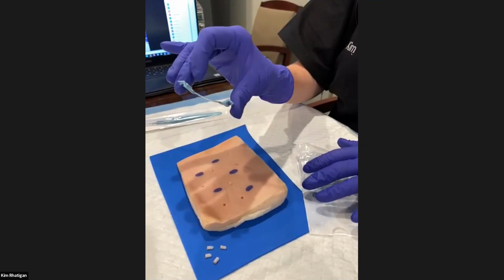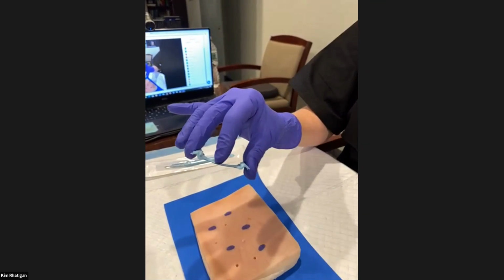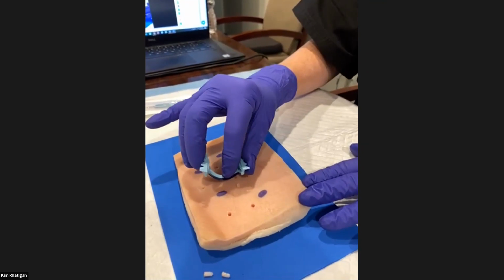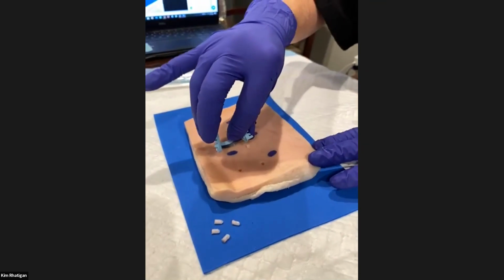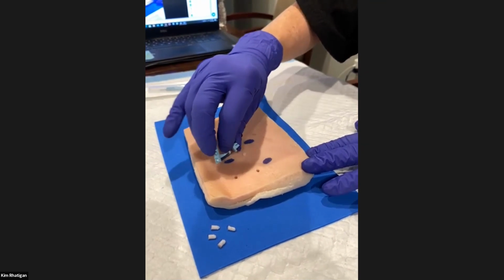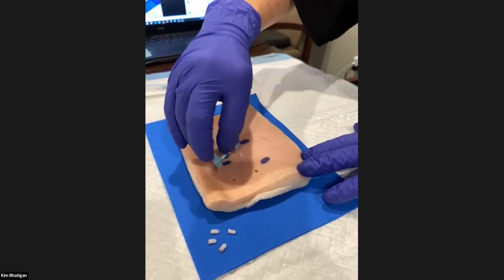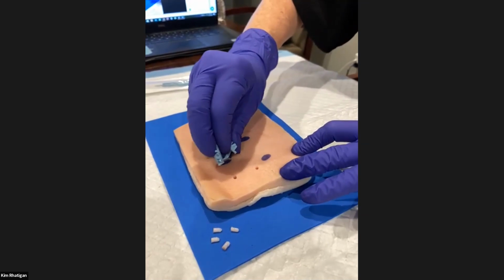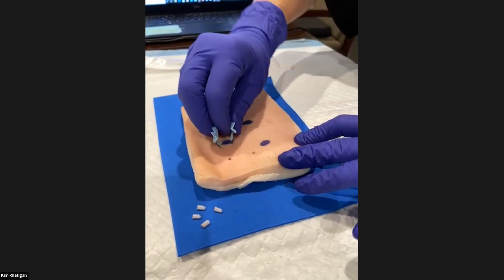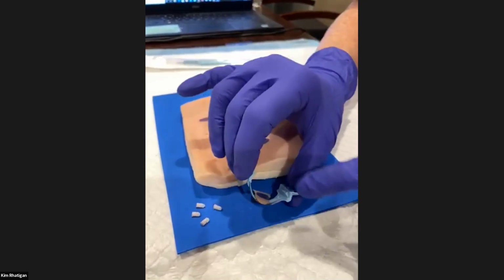You hold it between the thumb and the third finger, and you use the index finger to help you bend. You squeeze with your thumb and third finger and push it down, and that adjusts your radius. You start at a high angle, 37, and not super high, Kim. Well, good. I'm going to work on one of my little lesions here. In reality, you want to rock back and forth, so your thumb down and then your finger down, and you alternate. Okay, you're going at a super high angle, Kim. Look at the size of that radius. Oh boy. Now, if you bend this too far, you will break the blade.